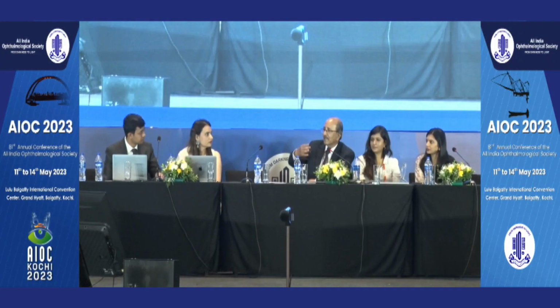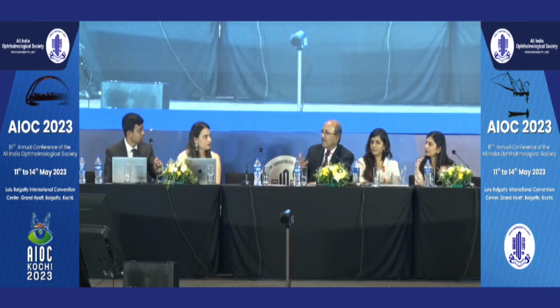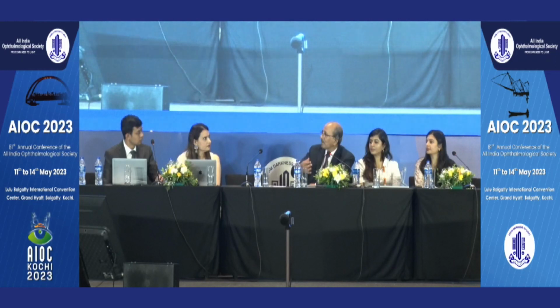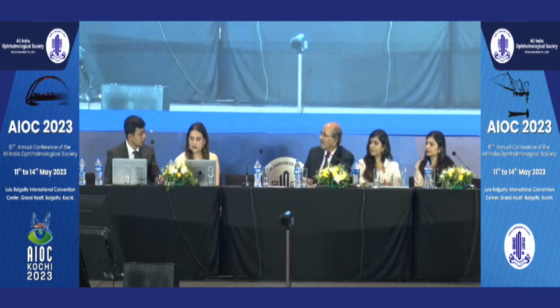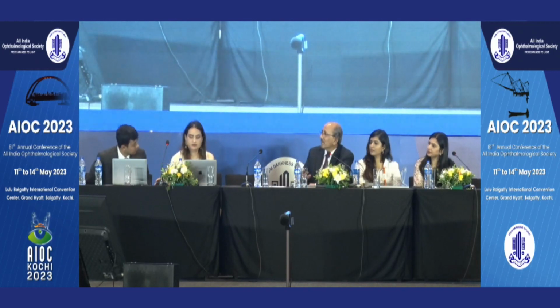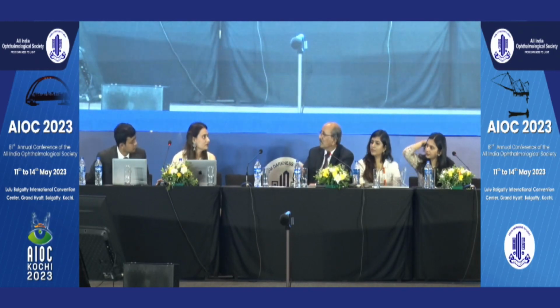If it is a low pressure, it will not even detect it. So it has to be adequately filled, and then if it comes still low, you can inject more. So gradually you have to inject, but if it is over-filled, that is also not fine. First, we were also trying it, how much to fill, but it comes with experience that it should not be low, it should not be very high, it should be just appropriate.